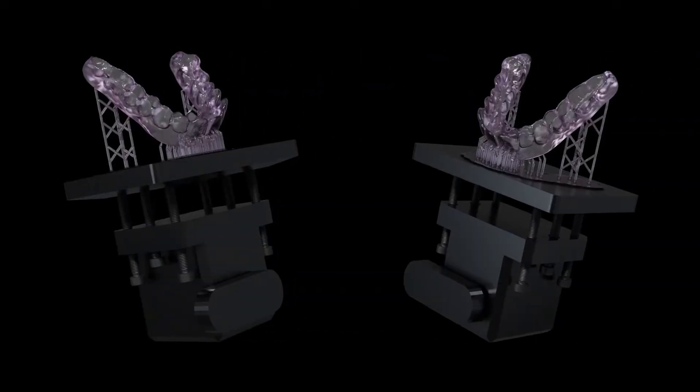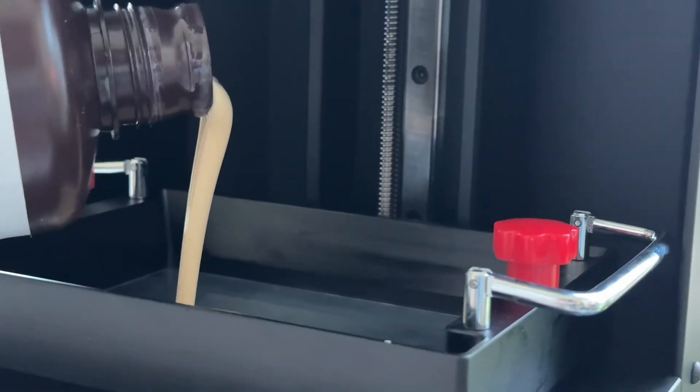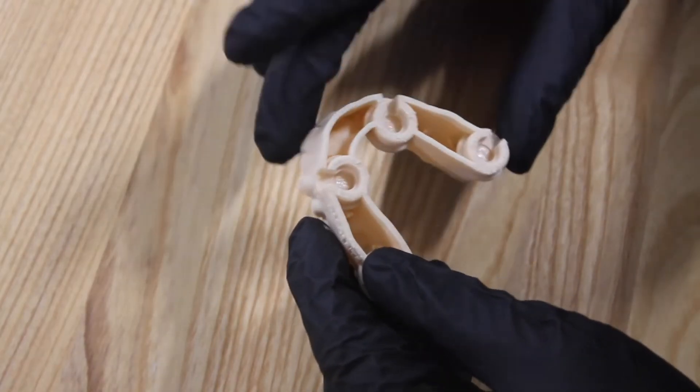Once the models are printed with your preferred 3D printing system, the next step is to glue the magnets inside the attachments. To do this, use a glue of your choice.